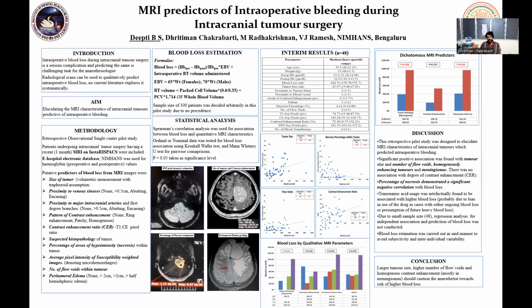Okay. Lastly, meningiomas, which are extra-axial tumors that do not have a blood-brain barrier, will always appear brightly enhancing. Schwannomas will also appear brightly enhancing because they are not of the brain. Okay, they don't have a blood-brain barrier. So always equate contrast enhancement with blood-brain barrier.